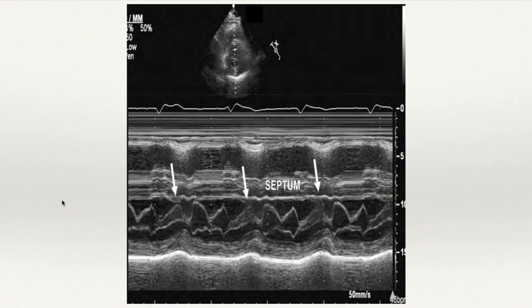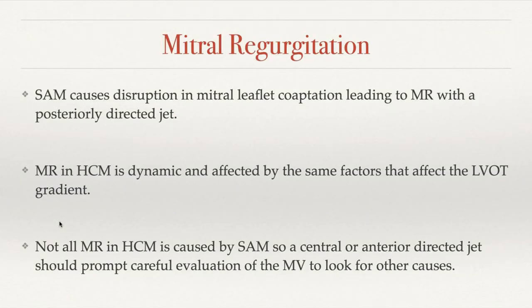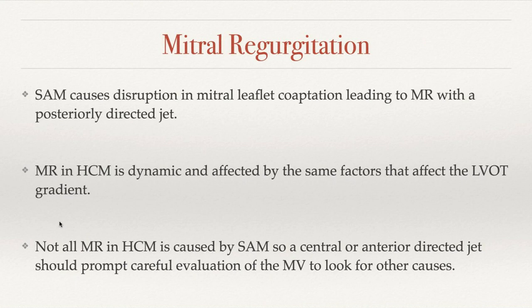On M-mode, you can clearly see the mitral valve leaflet going into the LVOT and causing obstruction. Because of this pulling force on the anterior leaflet, it causes disruption in mitral valve coaptation, leading to MR — usually a posteriorly directed jet since the anterior leaflet is being affected. Similar to LVOT gradients, MR is dynamic in HCM. If we see a central or anterior directed jet, it should prompt careful evaluation of the mitral valve to look for other causes contributing to the regurgitation.